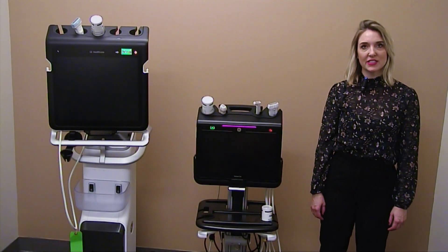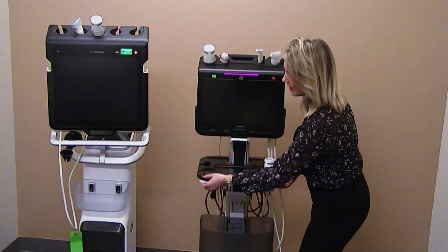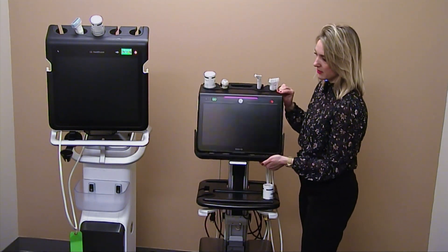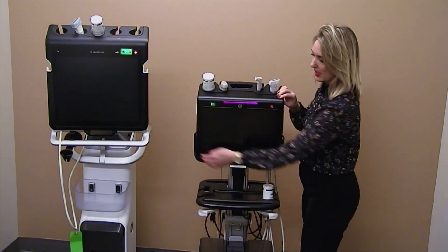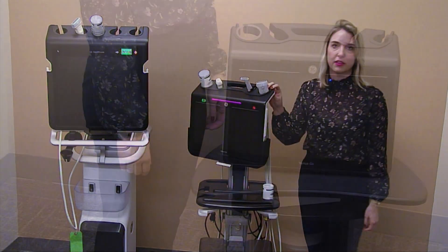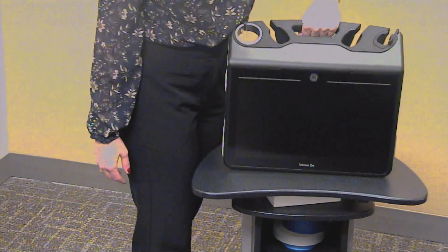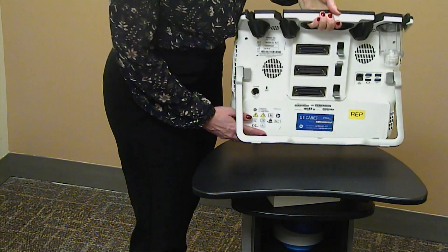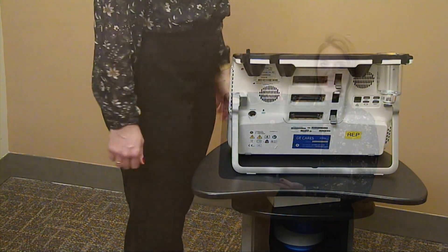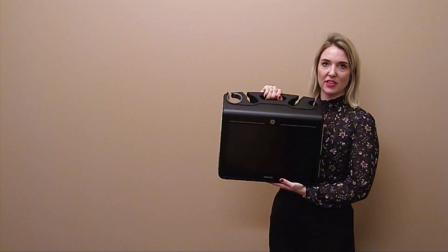For portability and easy use, the VenueGo can be moved up and down. The monitor can be tilted and swiveled side to side. The VenueGo can also be removed from the cart and placed on a flat surface using the kickstand in the back of the system, or placed in a cradle on a boom.